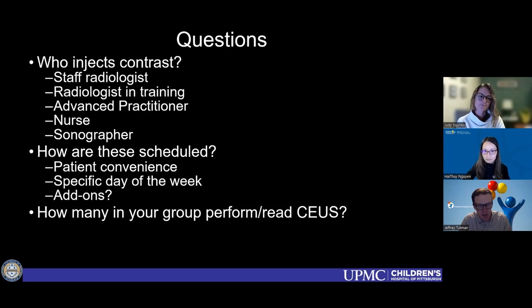For us, the injection is a little different whether it's a routine scheduled outpatient versus an inpatient that we're doing portably on the floor. Most of the time, if we do them as scheduled outpatients, we do them in our IR area because that's where our nurses are located. We walk over there with a sonographer, and the nurse is usually the one who does the injection. I've done a couple on the floor where I personally did the injection, and the floor nurse is just there to help with whatever, but it's usually just myself and the sonographer.